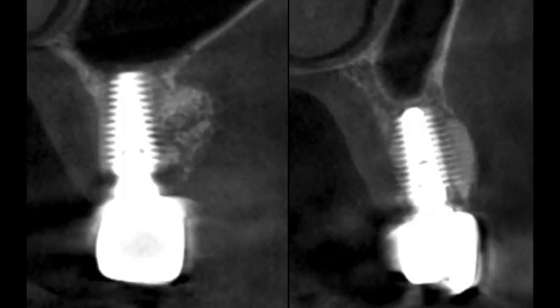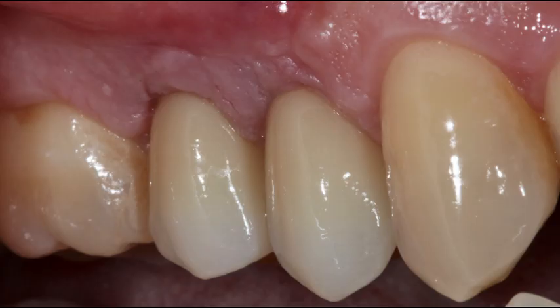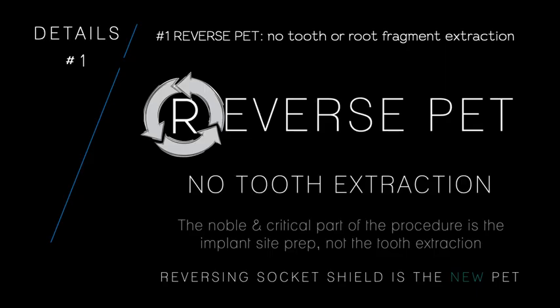And this is the CBCT, the sectional CBCTs, 4 years post-op. You can see how beautifully it holds all the grafting on the cyst, and how beautifully the implants are, and how beautifully everything is, and with almost no effort, so you can kiss complex goodbye.